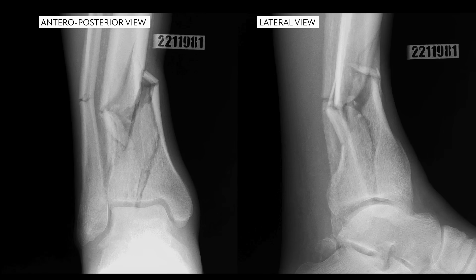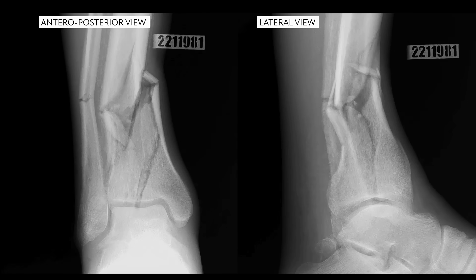You can see on the articular block it appears that there might be a split in the articular segment, and then more proximally in the diametrophysial region there appears to be a little bit of comminution.